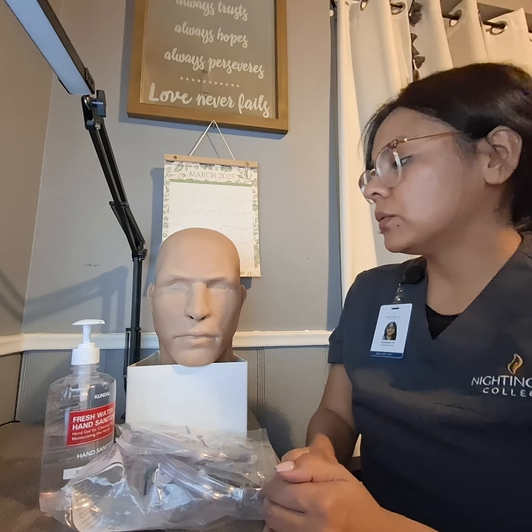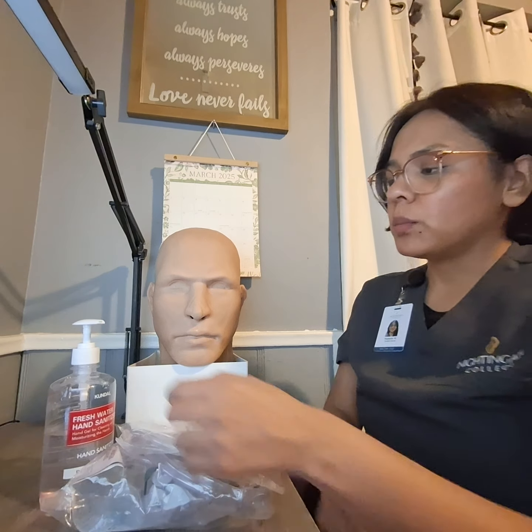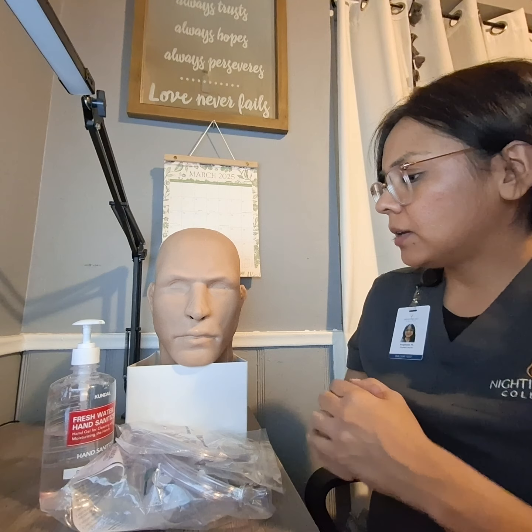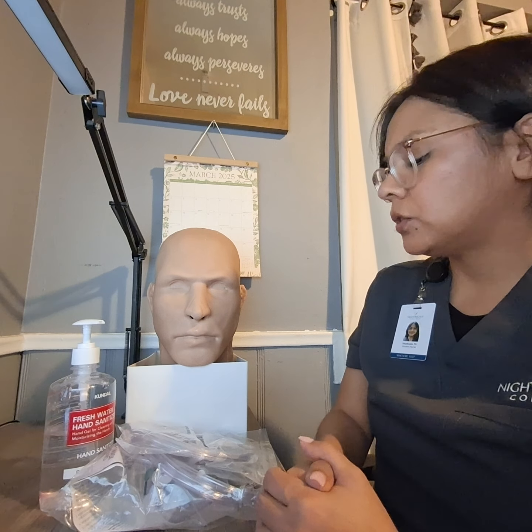I've entered my patient room. I've closed the door behind me to ensure patient privacy. I will perform hand hygiene. Hi, Mrs. Garcia. My name is Stephanie and I will be your nurse today. Can I please have you verify your first name, last name, and date of birth? Thank you so much for that.